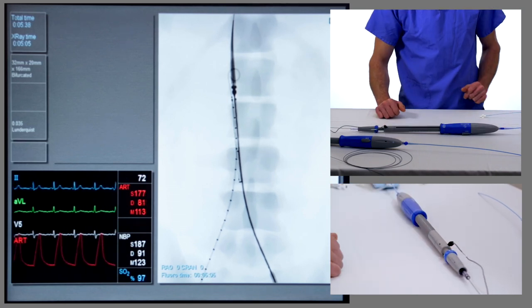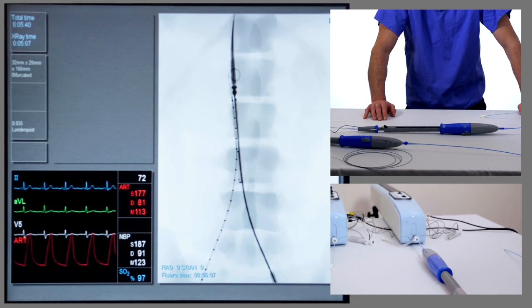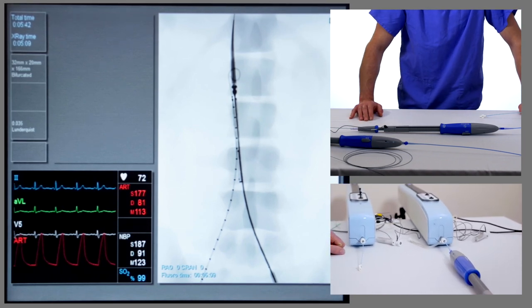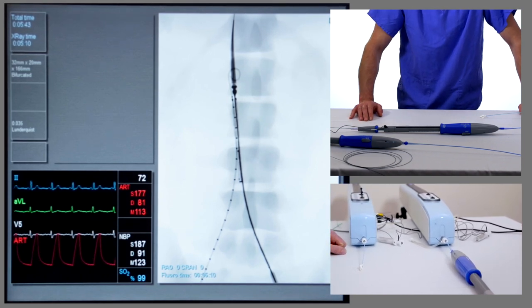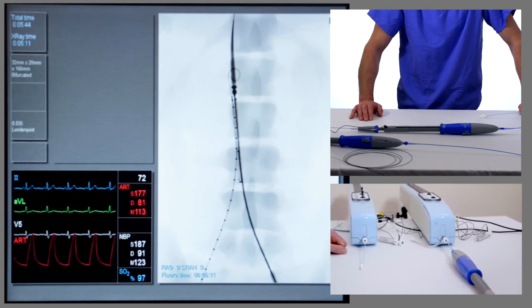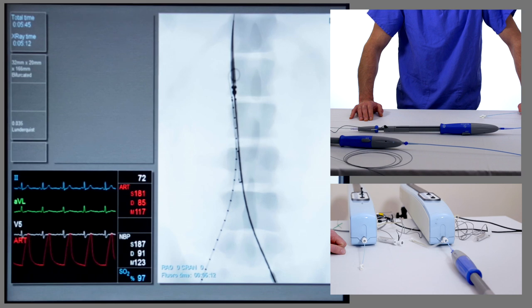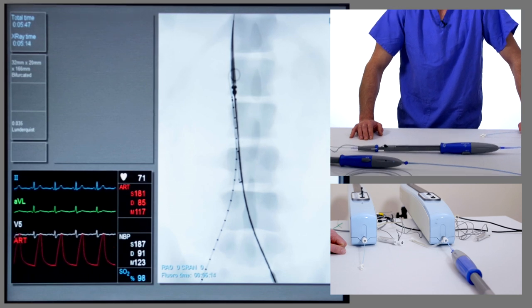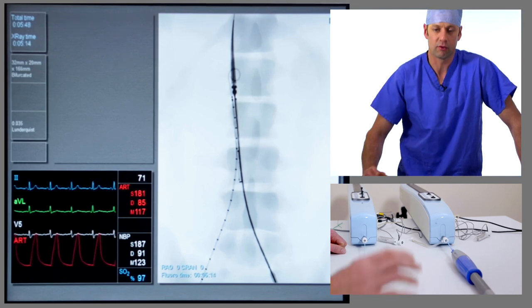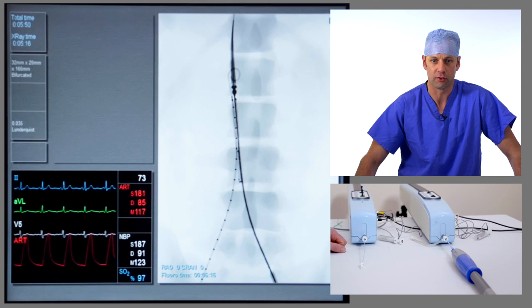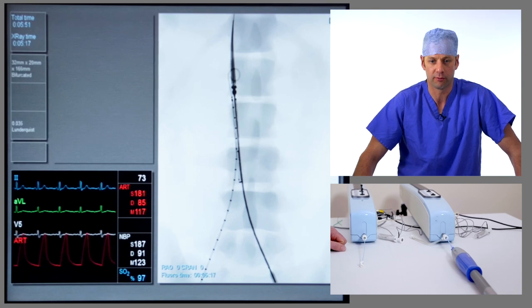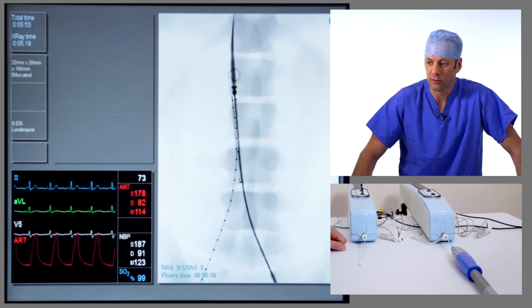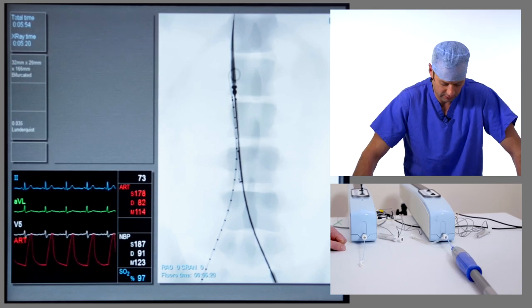Now it's time to do an angiogram. Typically for an EVAR, we inject about 15ml of contrast at 15ml a second, which gives a short but concentrated burst of contrast to show us the renal arteries.